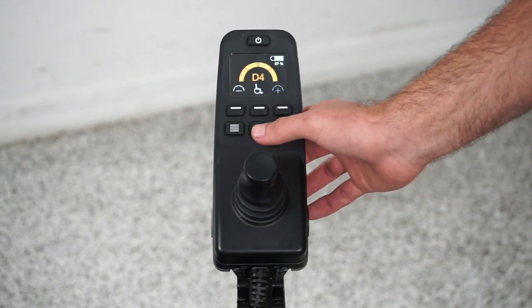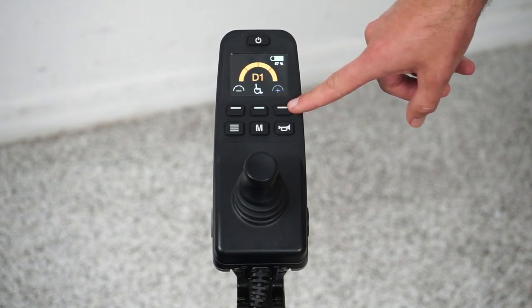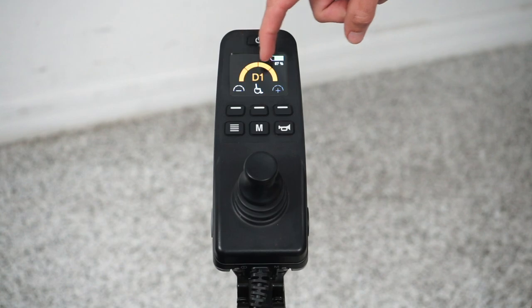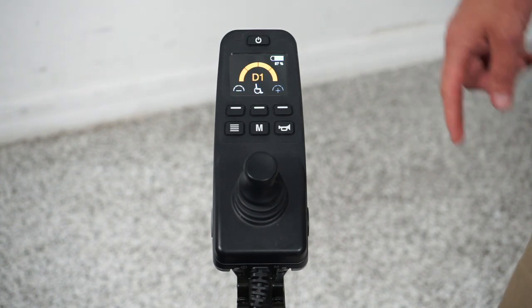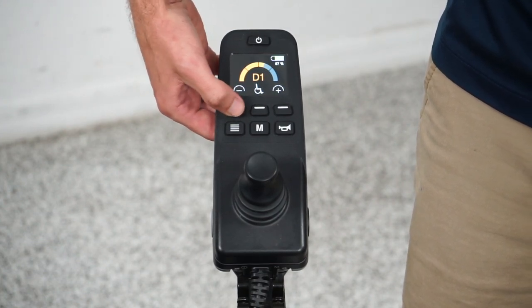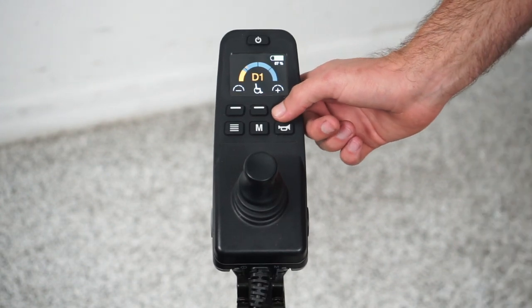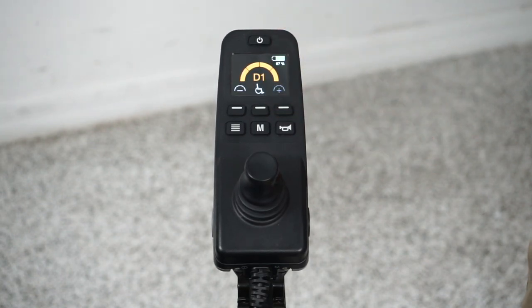Let me go to drive one and cover some of the other buttons. We have three buttons up here that control the speed within the profile. Drive one's top speed is maybe one and a half miles an hour, and this orange bar is completely covered, meaning if we push the joystick forward we'll go one and a half miles an hour. I can decrease this with the minus button — now the chair will only go maybe half a mile an hour. Then I can increase it — maybe it'll go about one mile an hour here, and now we're back to the full speed within this profile.